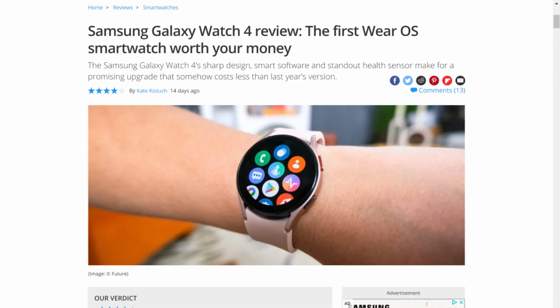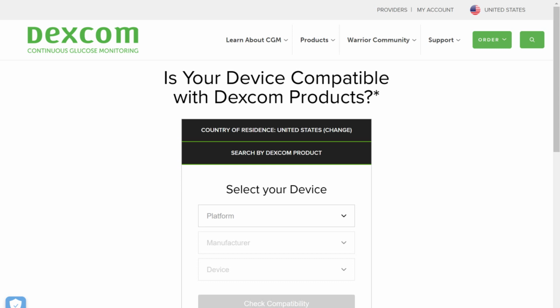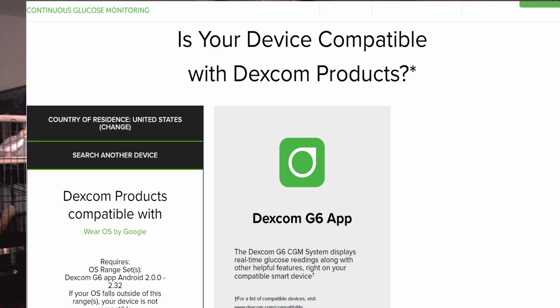All right, real quick, the Galaxy smartwatch utilizes a technology called Wear OS. Now, this is an operating system created by Google for smartwatches running Android. And if you go to the Dexcom compatibility website, you'll see a tool that allows you to see if your specific device will work with Dexcom. Now, as you can see here, the Dexcom website states that Wear OS is compatible, allowing the Dexcom G6 CGM system to display real-time glucose readings along with other helpful features right on your compatible smart device.